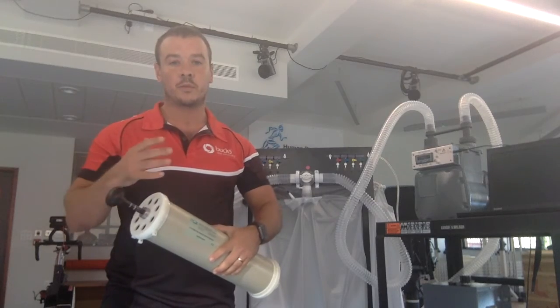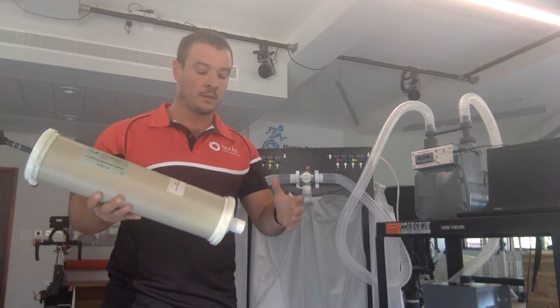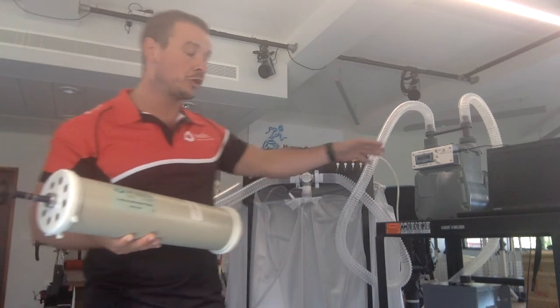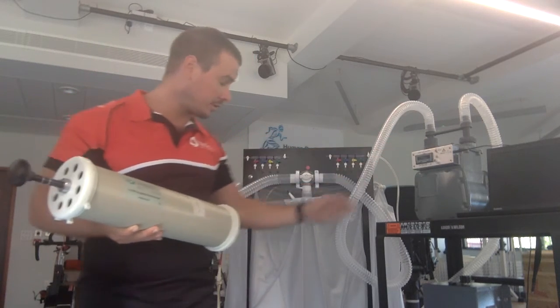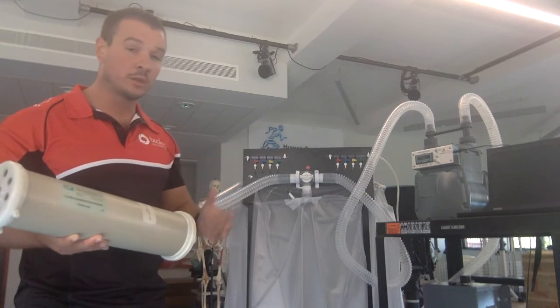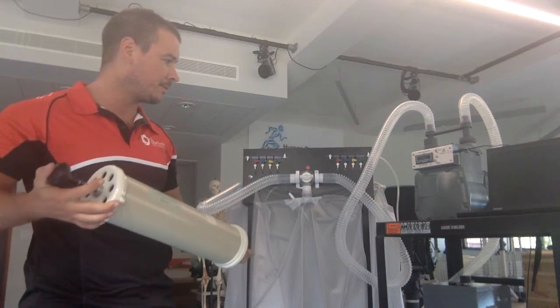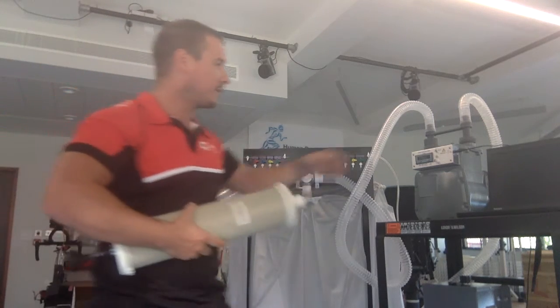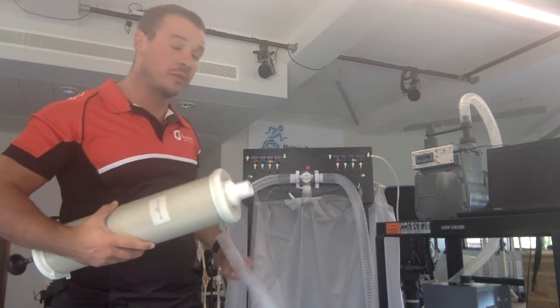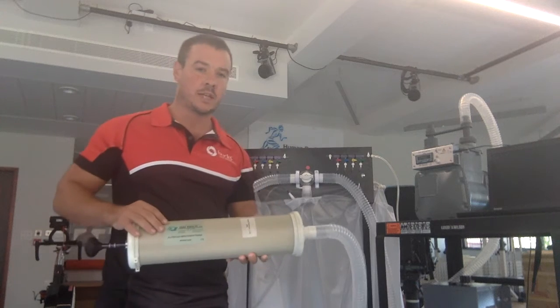Now that you've emptied your Douglas bags, you're ready to perform a volume calibration. A volume calibration is a check that the dry gas meter accurately measures the volume of air that's in the bag. In order to do this, you're going to require the Hans Rudolf 3 litre calibration syringe. Take the end of the plastic tubing from the inlet valve of the dry gas meter and attach it to the calibration syringe.